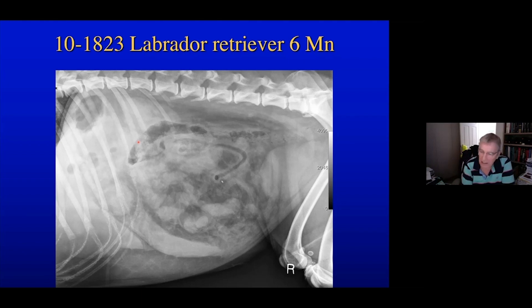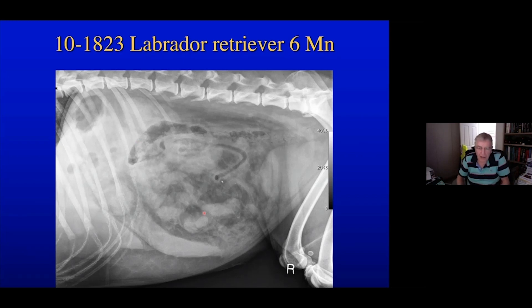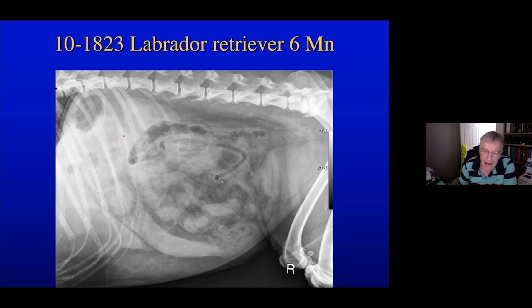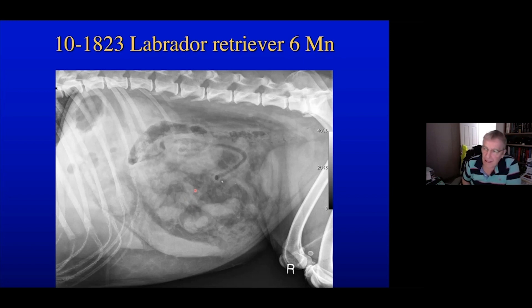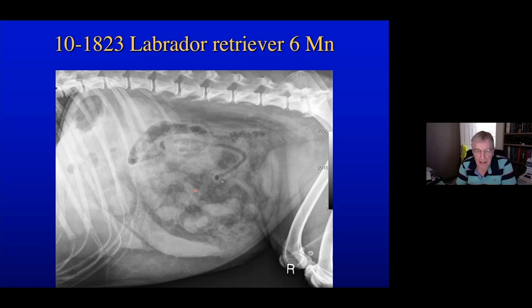Those who said peritonitis were correct. Ascites would usually have a lot more fluid, causing the abdomen to take on a ground glass appearance with gas-filled intestines standing out. But looking closely at these areas, we can perhaps make out small spots that could be gas opacity within that fluid and fat, which would also implicate the possibility of free gas.